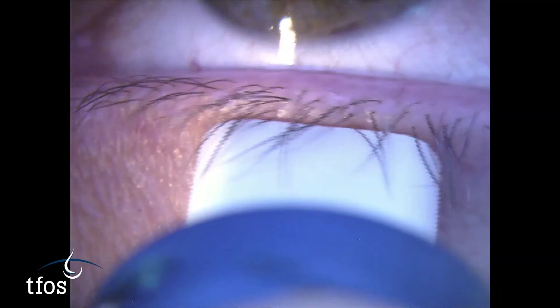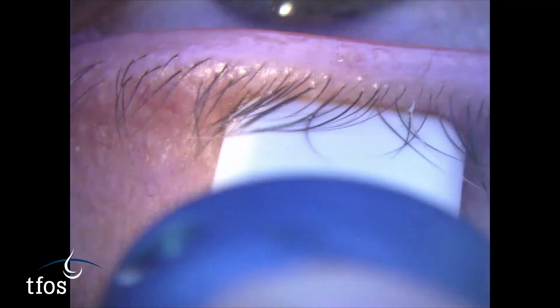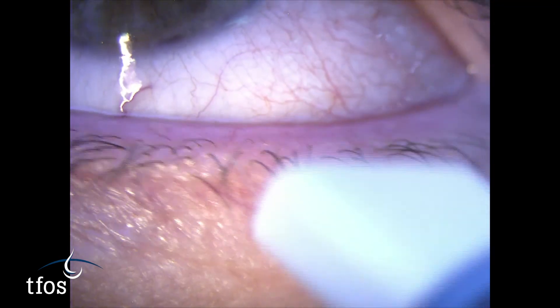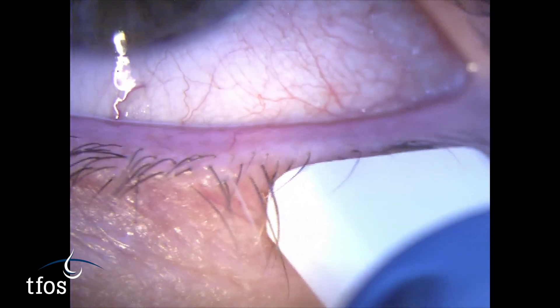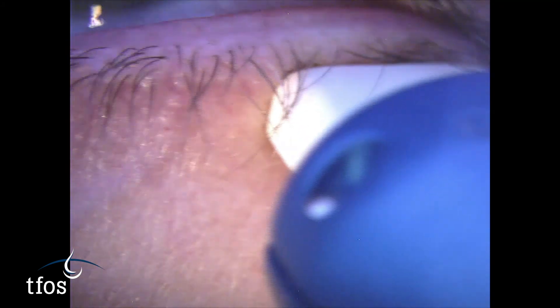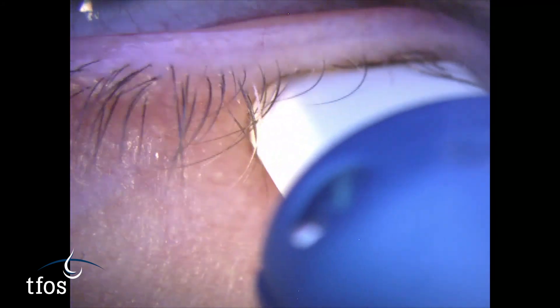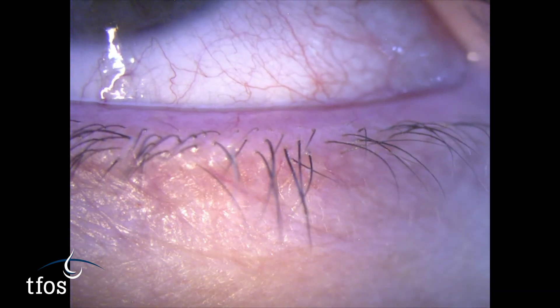In meibomian gland dysfunction, the meibum is thickened, opaque, and more difficult to express. The clarity of the expressed meibum and the ease of expression can be graded to monitor the severity of gland dysfunction over time.